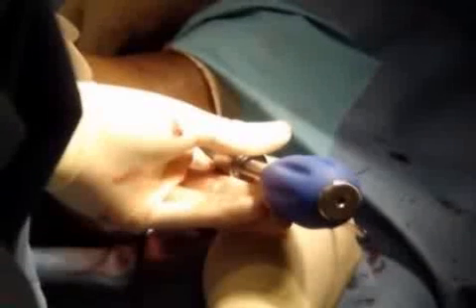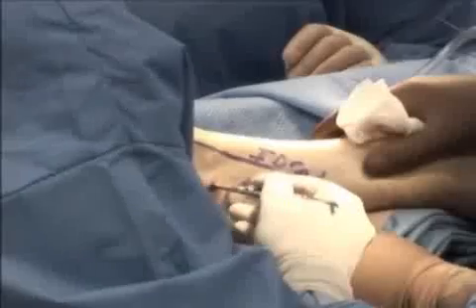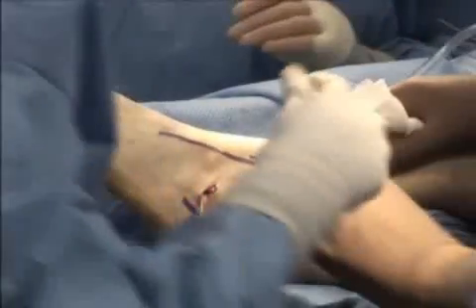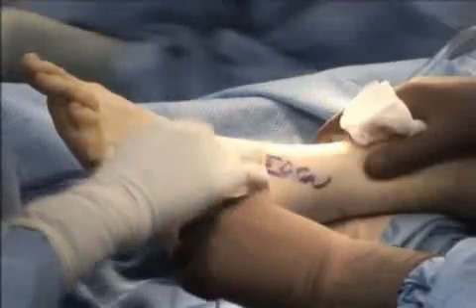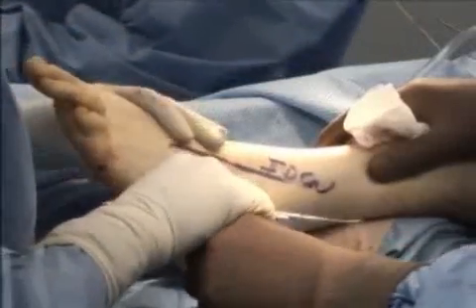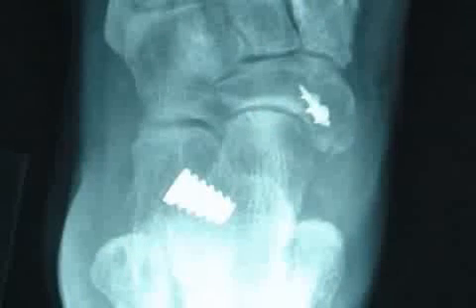Then you can remove the screwdriver. A helpful way of making sure the implant does not dislodge is to keep the hindfoot in eversion, or you can put instrumentation on the actual implant itself just to help stabilize it, and then remove the screwdriver and subsequently the guide wire. I prefer to get final intraoperative views, verifying the placement in the tarsal canal both in the lateral plane and the AP plane, making sure the implant is to the talar neck bisection but not medial.